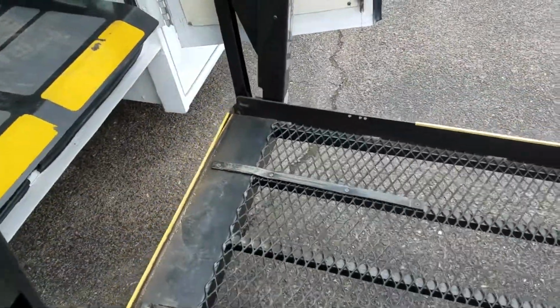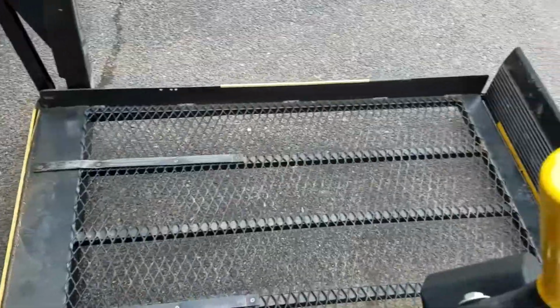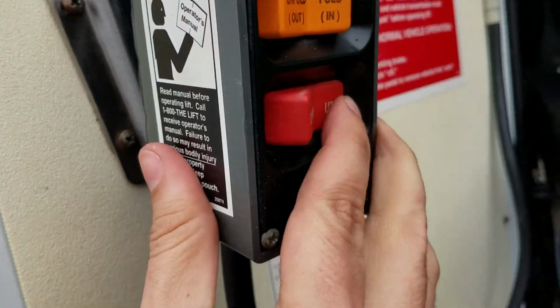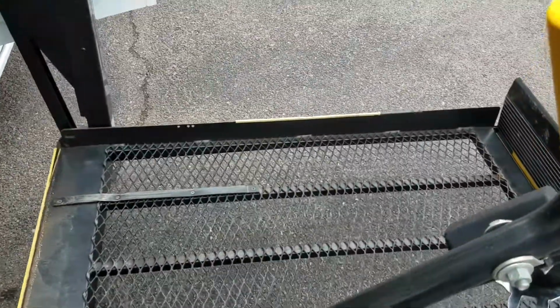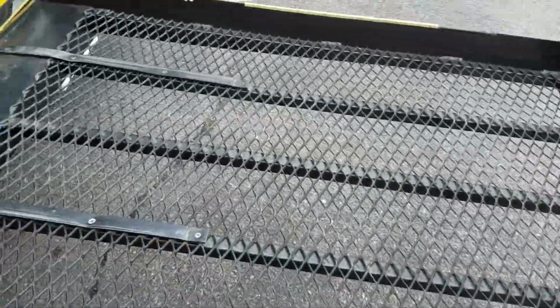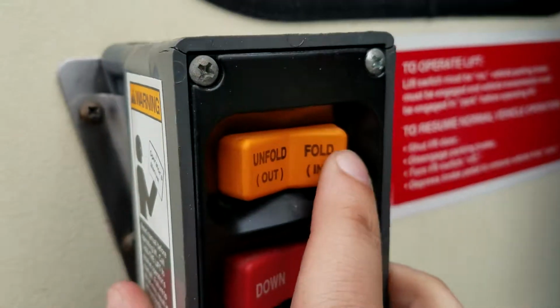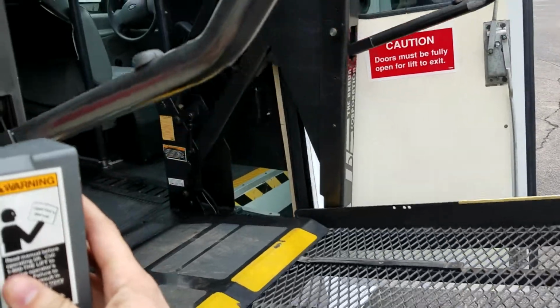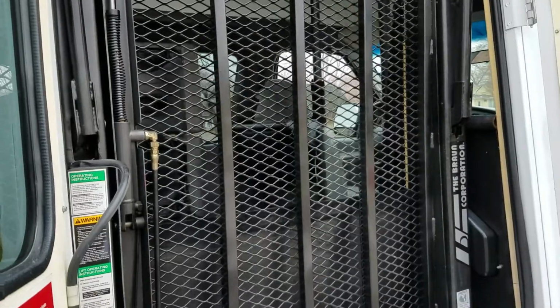We put a new hydraulic switch on this lift. It was fairly expensive, but as you can see, you load right up, wheelchair right on here. It's got a couple handles and even a seat belt in case you need those. When it's time to go back up, we reverse the process, hit the up button, and then we hit the in button. So left gets it down, right gets it up. Lift works great.